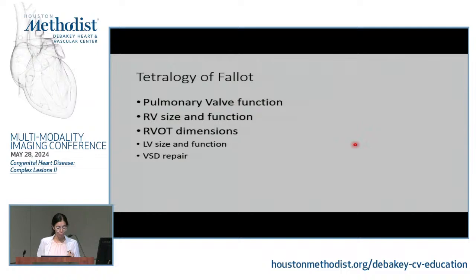Okay, then it's very important to document the RVOT dimensions. Why is that? Who cares about the RVOT dimensions? Measuring our stroke volume. Well, stroke volume is important, yes, to calculate that. But this population has a more pragmatic reason. Because you want to plan, if they have stenosis there, put a conduit, or if you want to do a transcatheter, depends. Diameter. Yeah, that's right.